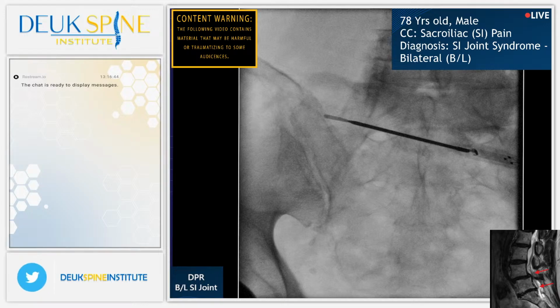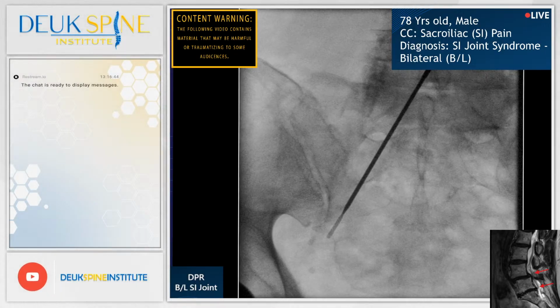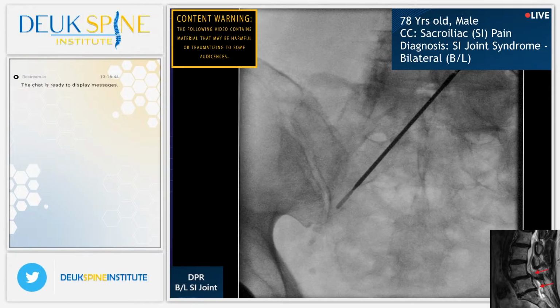I want to try to get down a little bit. Let's change the tip. I'm going to try to get a little further south. I'm happy with the north. The south, I want to get a little bit more. South means down by the feet. Shot. That's too far south. Shot. Shot. That's the tail end there of the joint. Quite literally the tail end. I just felt one of those pain nerves right there.